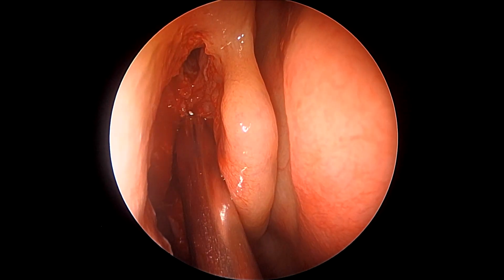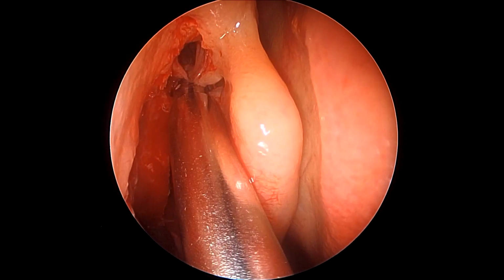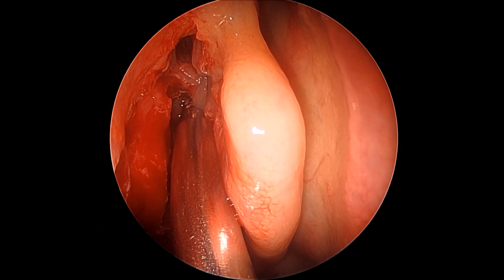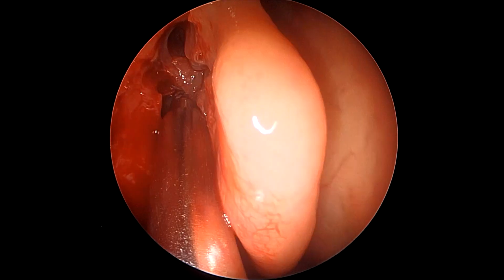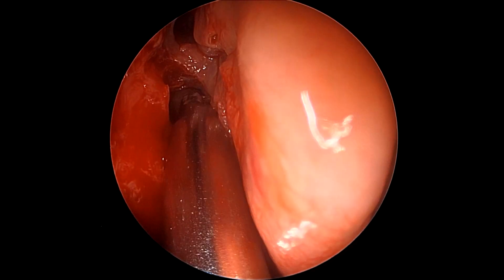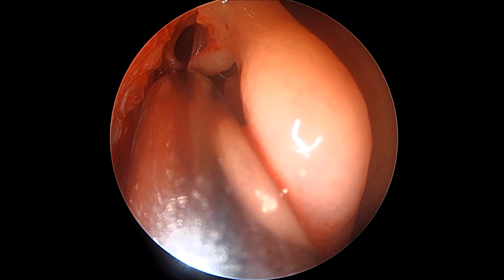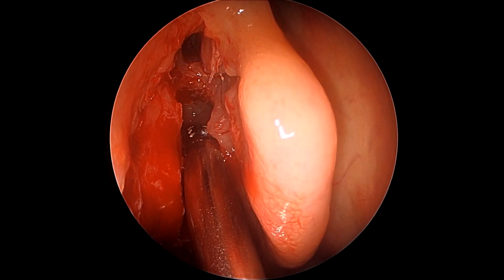Now we use the microdebrider blade to again debride the erstwhile fractured posterior wall of the agger nasi and remove some of the excess polypoidal redundant mucosa in the region of the frontal recess to give us better access towards the right-sided frontal recess cells and possibly the frontal ostium.